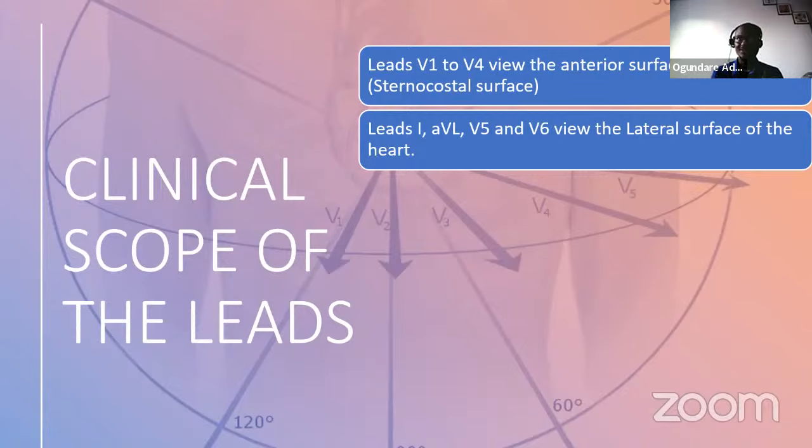They are attached on the lateral surface of the body, at the anterior axillary line and the mid axillary line. That is consistent with V5 and V6 leads as well. So they show the lateral surface, not anterior, the lateral surface.